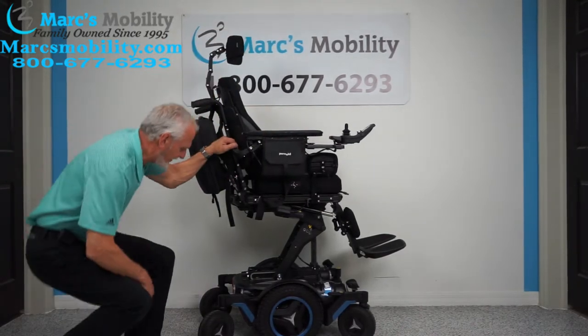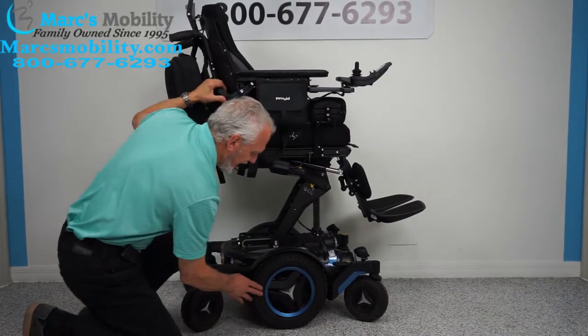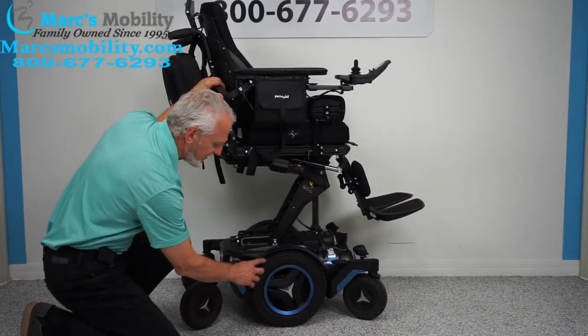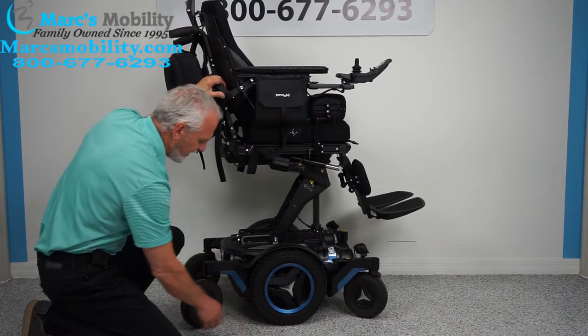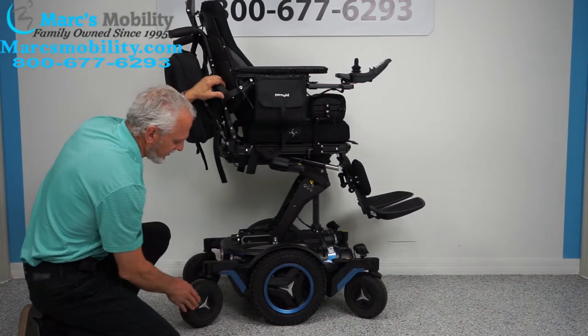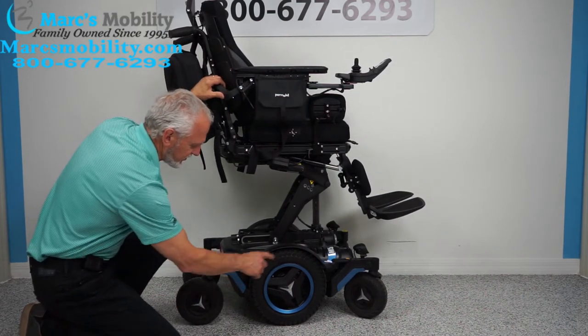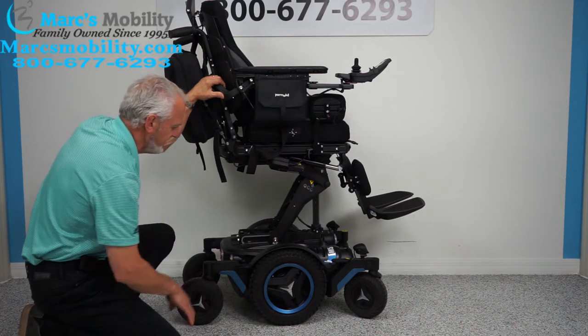With the seat elevated, let's look at the base. You can see the aggressive tires with knobs — these are your 14-inch drive tires and they will not mark your floor. The rear tires are also aggressive. These are custom tires, not standard on this chair — the previous owner paid extra for these. You have them all the way around the chair.